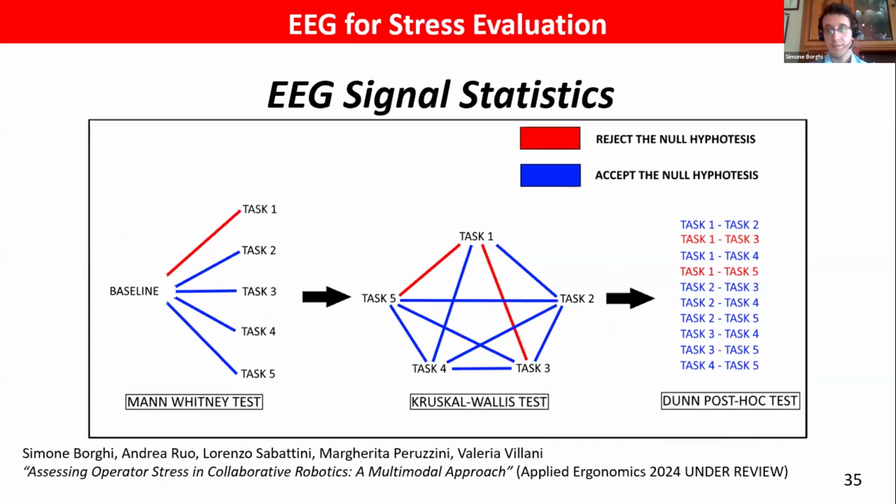Some, analyzed by me and exposed in a paper currently under review, could be whether there is an actual correlation between the individual perception of stress and the metric extracted from the signal. We could rephrase it as: how much does what I can get from signal analysis agree with what I perceive personally as stress? For this purpose, we wanted to go into detail by examining each individual's perception, a process illustrated in detail in this figure.